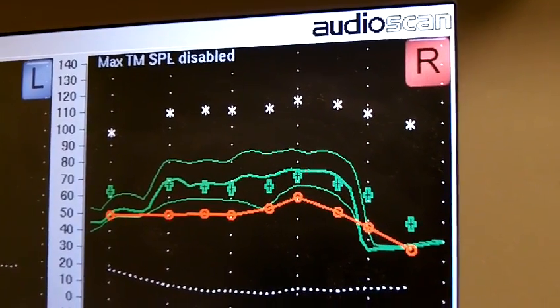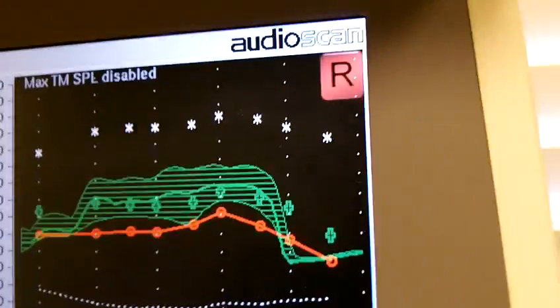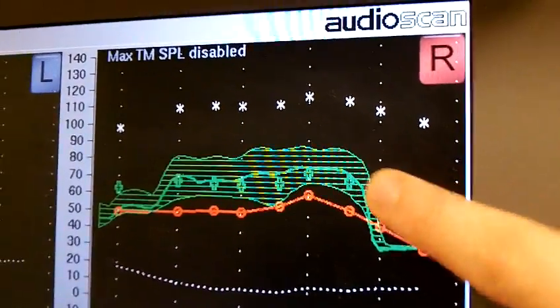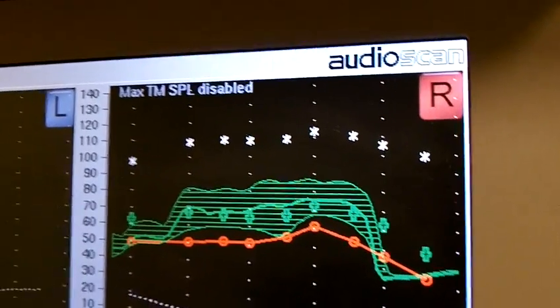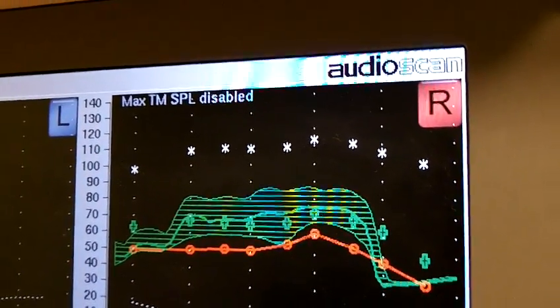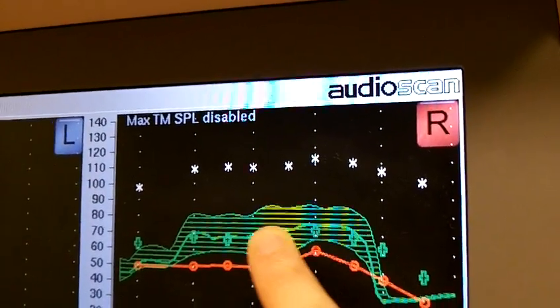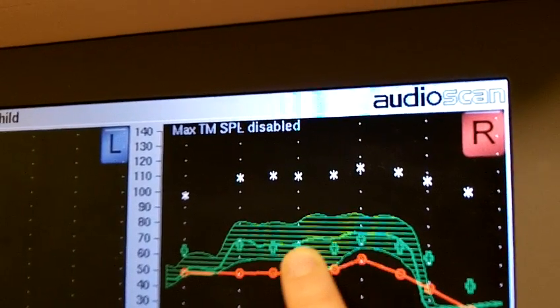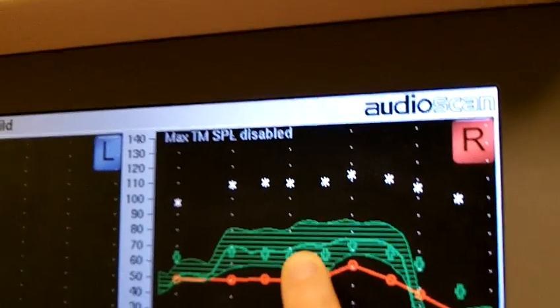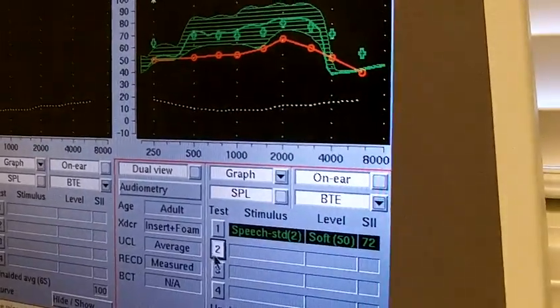with other persons. So that looks pretty good. It's still maybe a little bit loud, but as you can see on the side here, it dips. This is because Sound Recover is turned on in this hearing aid. If you were to go in and turn it off, this would come up as well and probably meet those targets pretty well. But as you can see, it's pretty close. If I was fitting this to a patient, I might turn it down 1 more in this area, but overall it looks pretty good. So then you're going to want to run your other intensities.